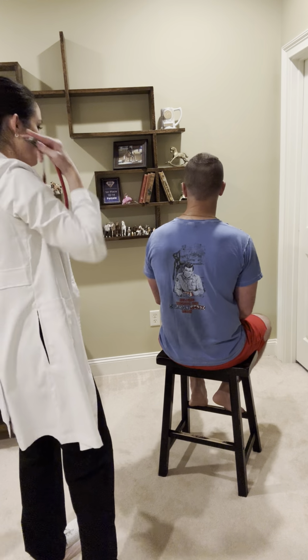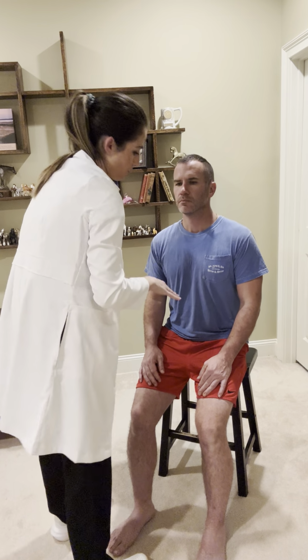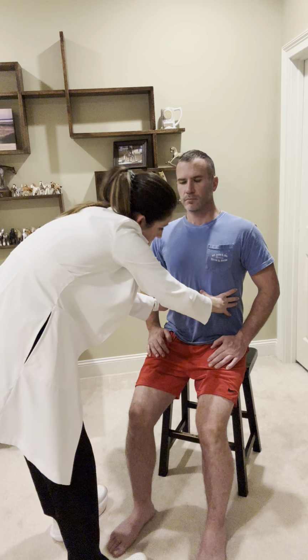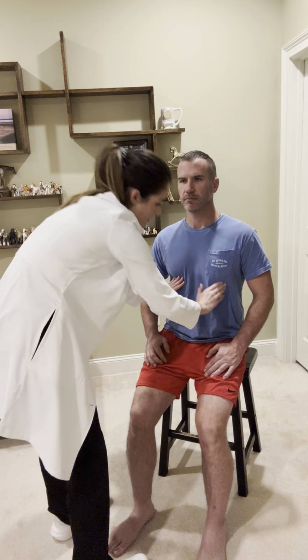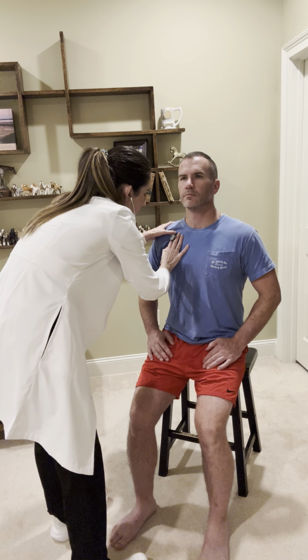All right, you can turn around and face me. Again, we'll inspect for symmetry and any obvious deformities. We are going to palpate for symmetrical expansion. Take a deep breath. Okay, we're going to palpate for tactile fremitus. 99, 99, 99, 99. All right, we're going to auscultate again. Take a deep breath.